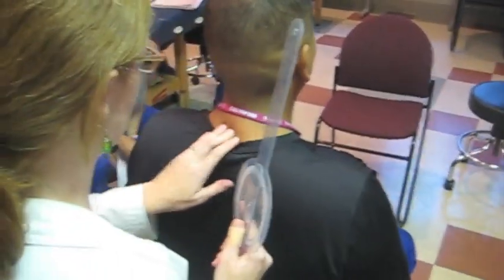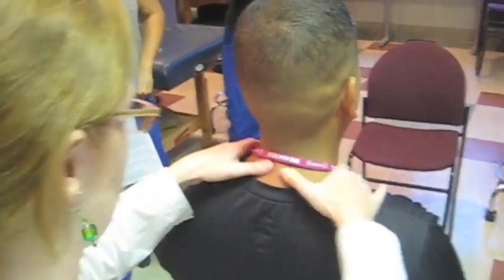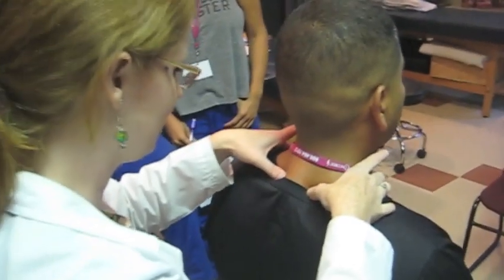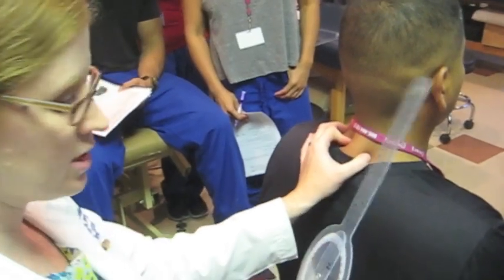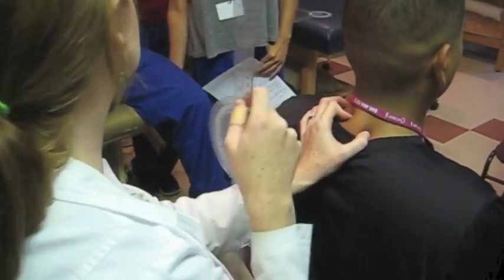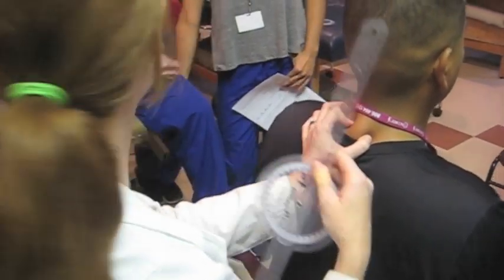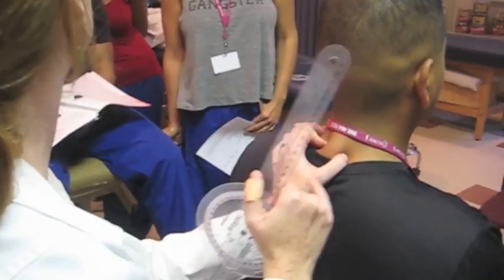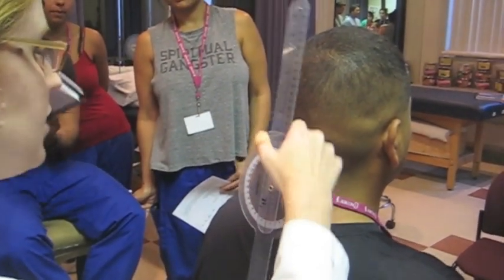The fulcrum is over the spinous process of the C7 vertebra. So we've got C7 here. And what is my stationary arm? Spinous processes of the thoracic vertebrae. It says midline of the trunk or perpendicular to the floor — we're going to do perpendicular to the floor. We assess a lot of patients with abnormalities, so their thoracic spinous processes may not be in line. So C7 fulcrum, perpendicular to the ground. And what's our moving arm?